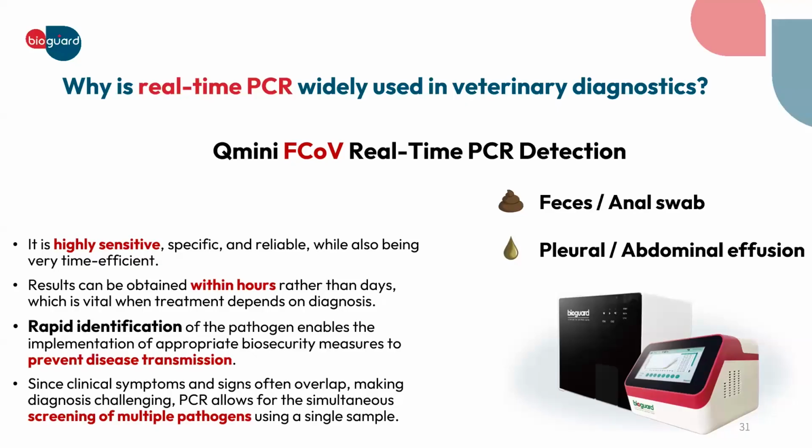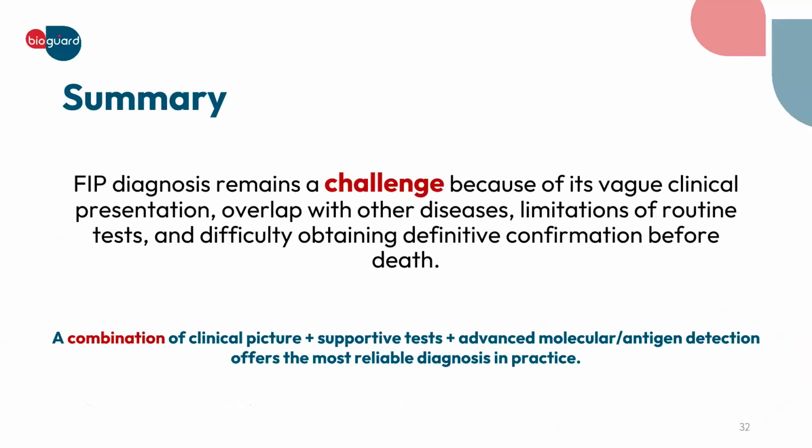Some are in a hidden form, or get mixed with other diseases occurring in the body. So as I say, screening of multiple pathogens at the same time, if there is some symptom present, available in the market, of course, it's very important to choose that for correct diagnostics.